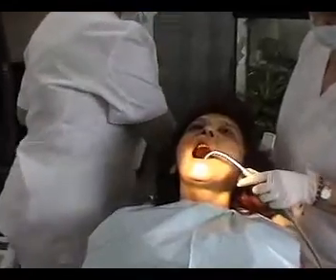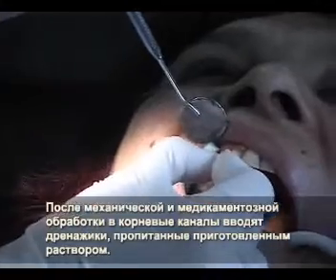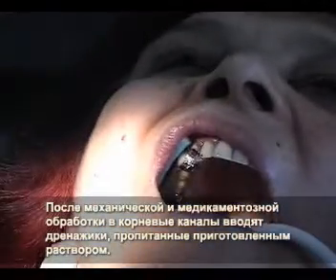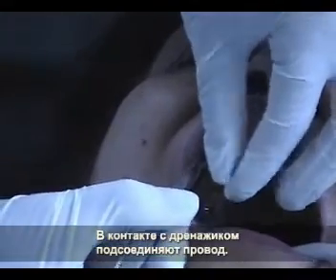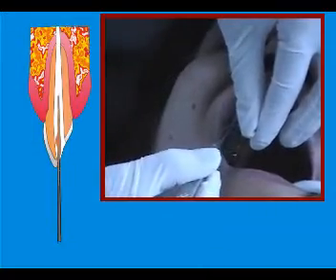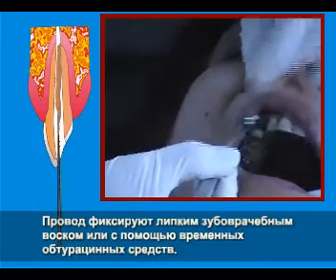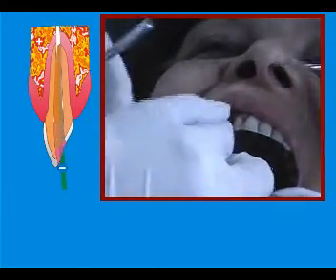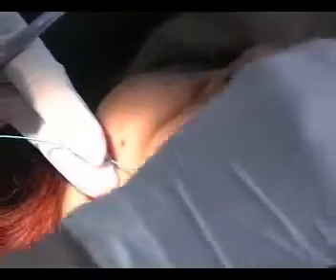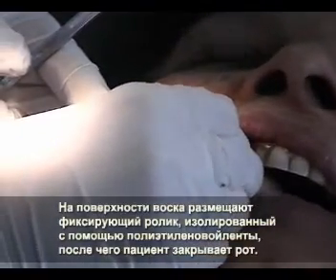After mechanical and medicinal treatment, drains soaked in the prepared solution are inserted into the root canal. A conductor is placed in contact with the drain and is positioned by melted dental wax or temporary obturative facilities. A fixing roll isolated by polyethylene band is placed over the wax, and the patient closes her mouth.